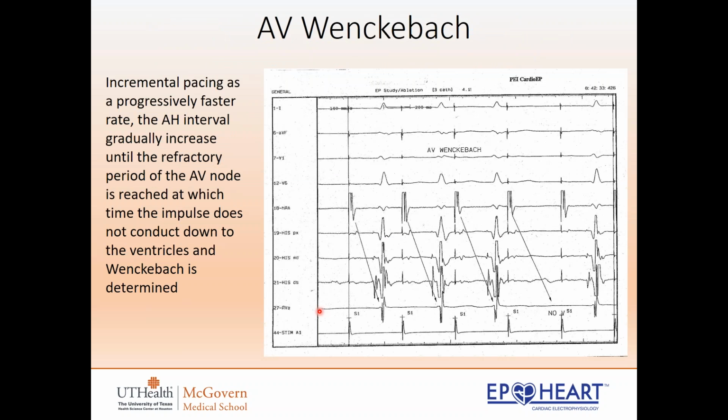And this is what it looks like with the catheters inside the heart. We actually are pacing the atrium, and you can see the conduction sequence going down. So this would be paced, HV, paced, HV, and you can see this time getting longer and longer. And then eventually we drop a QRS, and it goes back shorter. So it's exactly what you're seeing on the surface EKG that you're probably used to, but now we can see it inside the heart and where exactly that lengthening is occurring.